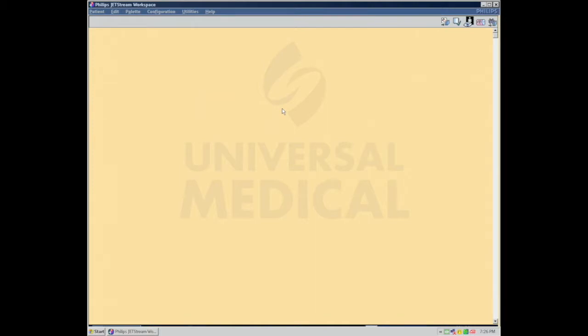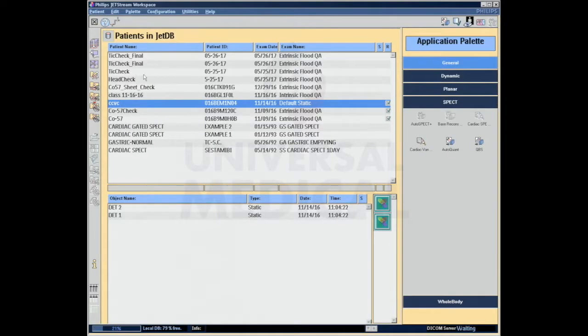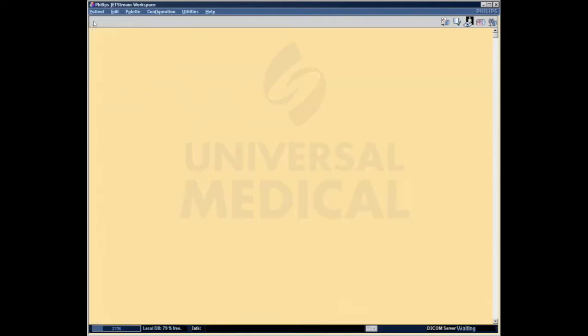In this video, we will be discussing patient drive space utilization, local patient database, and how they relate. If I look down here at the bottom, I'm going to see my database says that I'm 21% utilized. I have 79% of my database free. Yet if I go and look at my patient browser, you're going to see that I don't have a lot of patients in here. I have some example patients and some quality checks, but I don't have a lot of patients. Well, why is this thing reporting that I'm 21% full?